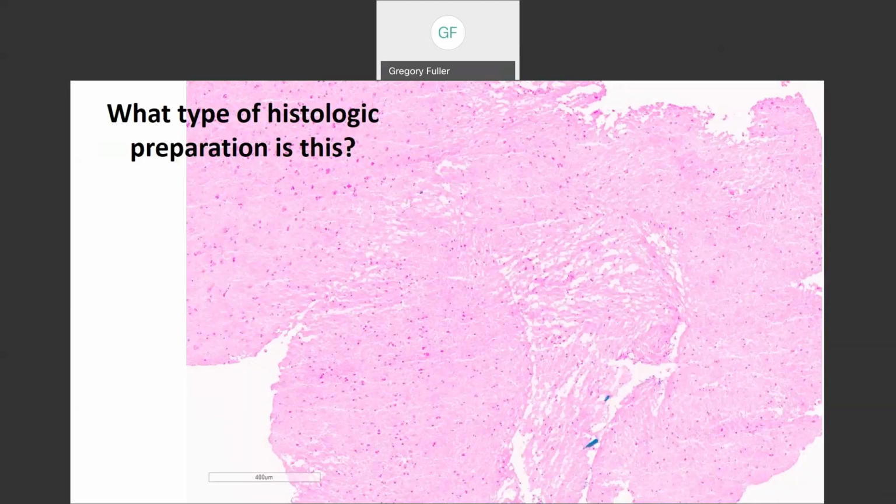And it's these ice crystals. See the linear arrays in different directions? Now, why is that important? It's important for two reasons. Number one, the nuclei that you're looking at are likely to be distorted, right? The cell shape is likely to be distorted as well. And number two, some antibodies don't work. Yes, Dr. Gilbert, exactly. For example, S100 protein, many of those antibodies are notorious for not working on frozen section, all right? The antigen, the epitope is simply masked, right? You won't see it, and you need to know that.